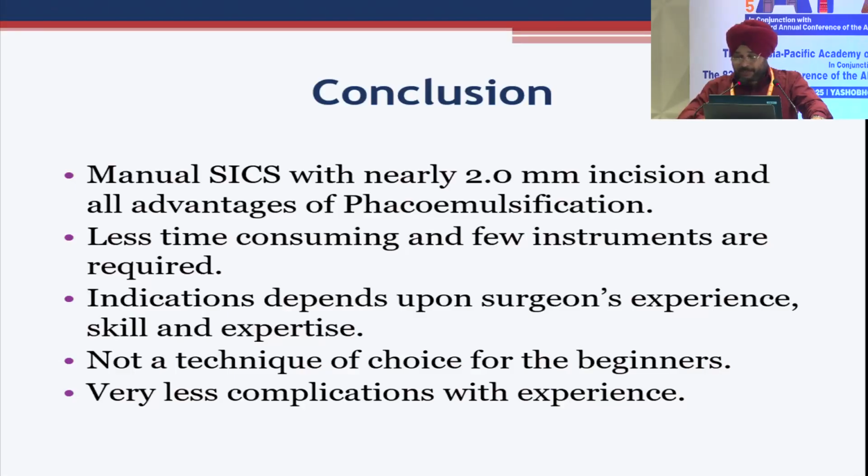I did more than 200 cases with this technique, and my average astigmatism is 0.8 diopter only, and there are few complications. For the first few days we can encounter edema at the incision site at the sclerocorneal tunnel. Superior corneal edema may be there, but that subsides after the 5th or 7th day. We are going to publish the series of 200 cases recently. The average endothelial cell loss is approximately 150 only, and there are few complications after experience.